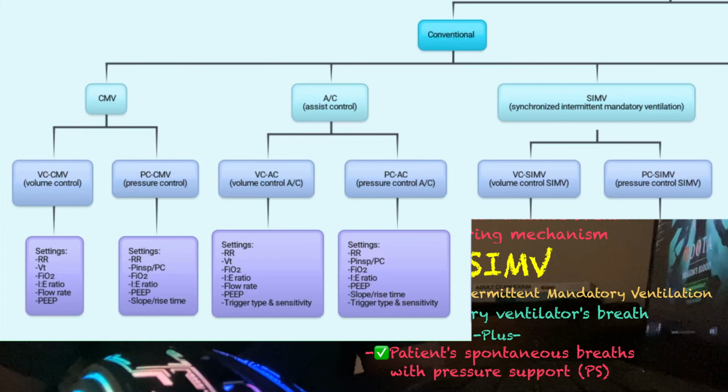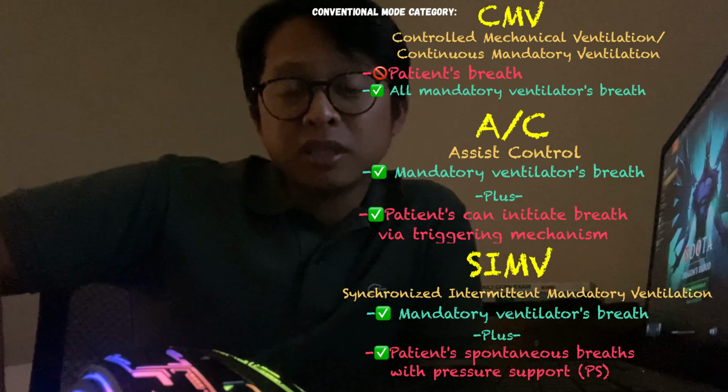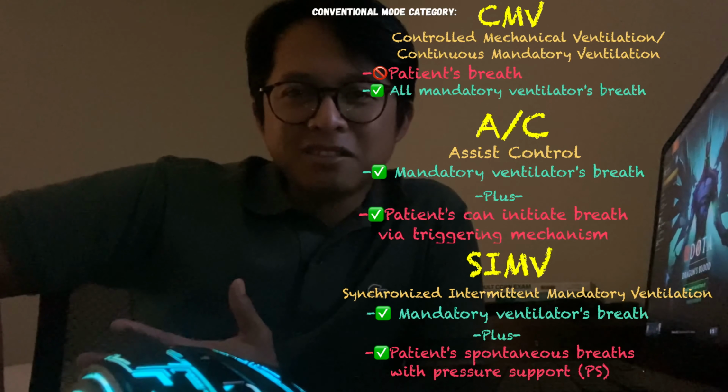CMV mode can be VC or PC, and the machine does the job. AC mode can be VC or PC, but the patient can trigger the breath, and the machine gives the preset breath that the operator set. Okay, and then the SIMV mode can also be volume or pressure control, and the patient can breathe on their own between set ventilator breaths or in synchrony if the patient triggers a breath near the mandatory breath. Okay, so that's it.